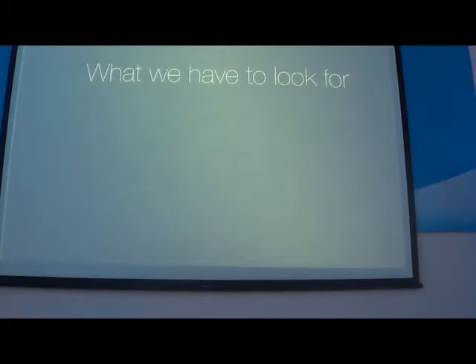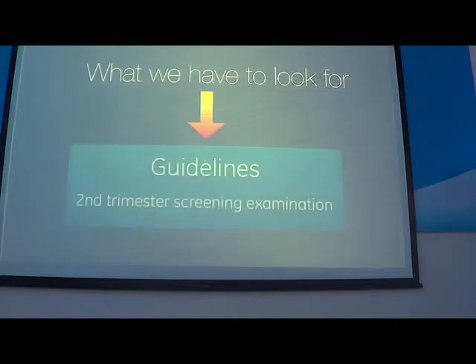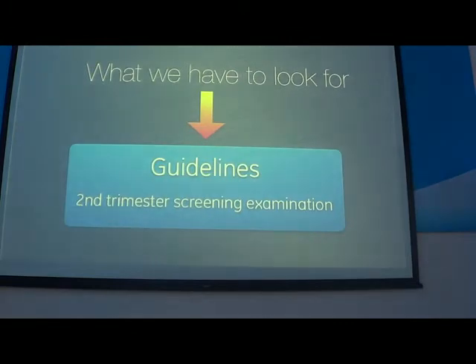So we saw all that can be seen, but it's different what we have to look for if we do the screening examination. Trên đây là các cái hình ảnh mà ta có thể nhìn thấy, nhưng mà ta phải tìm cái gì. And for this you need guideline. You have to know what you have to look for.